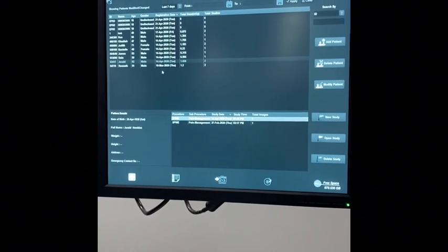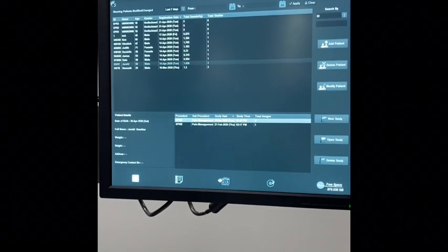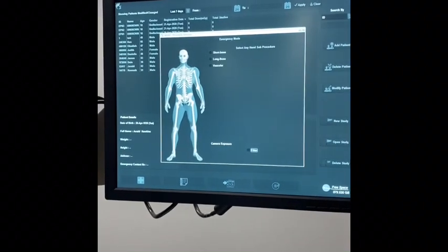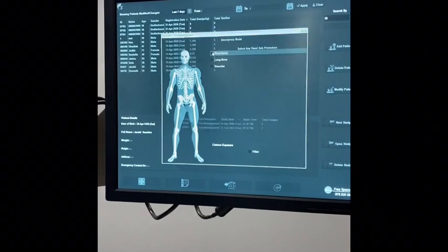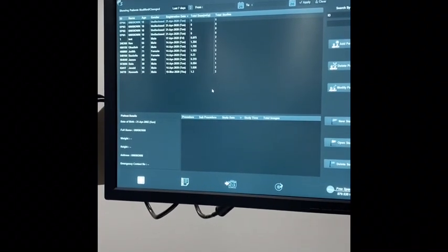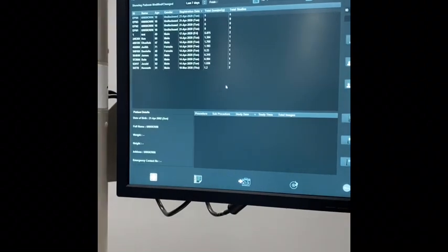These are where all your studies will be stored. If you ever need to do a quick emergency study, you hit that, select the anatomy of the body, select it, and you're automatically ready to go. It sets the right KV and MA and you're ready to start taking shots.